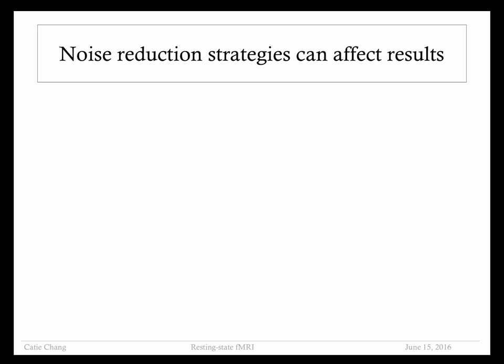But other things, like the depth of breathing that I just showed, are really low frequency artifacts. So in that sense, it doesn't help that much to acquire the data with a faster TR, because it comes from a BOLD-signal-like mechanism, and it's very slow, so it's less clear how to take that out using frequency information.